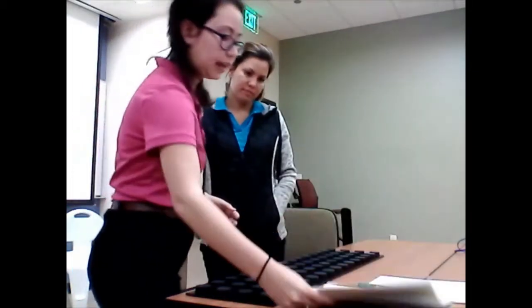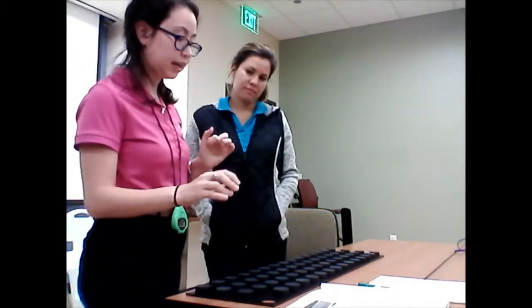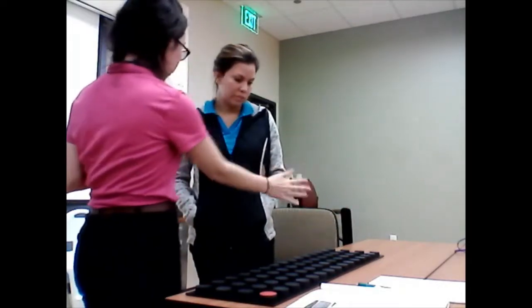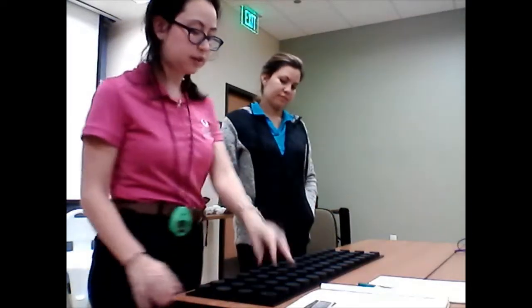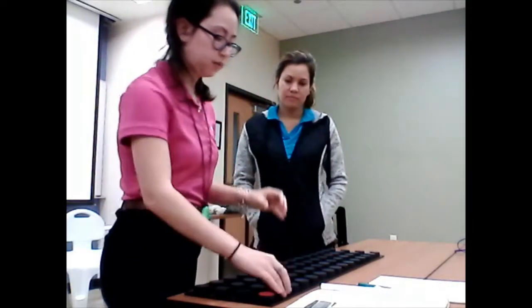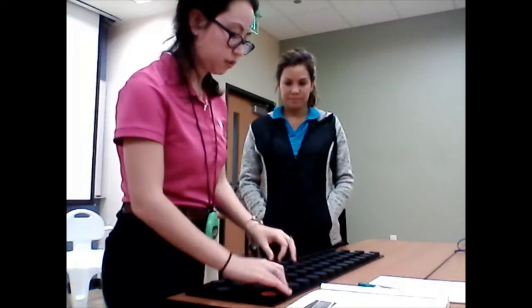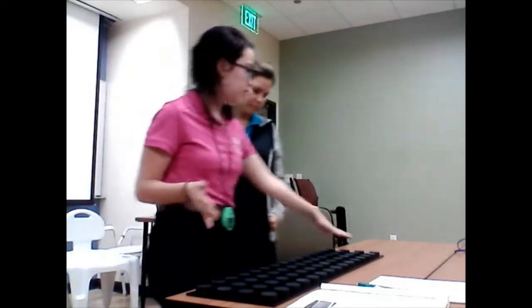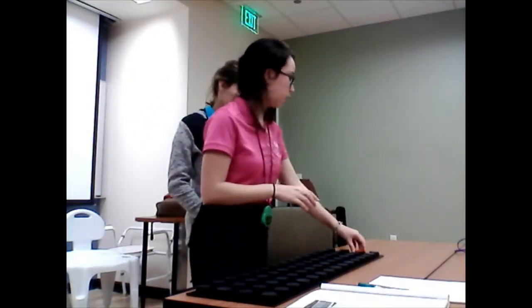You begin with your left hand, lift the block, rotate it with your right hand, and place it with your right hand. You're going to work your way towards the left side of the table. So as an example, you will do this. Pick up with your left. Once you reach the left side of the board, you're going to rotate. You're going to start on this side. You're going to pick up with your right and place with your left.